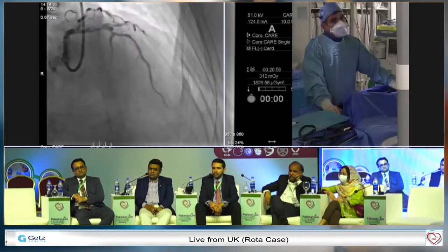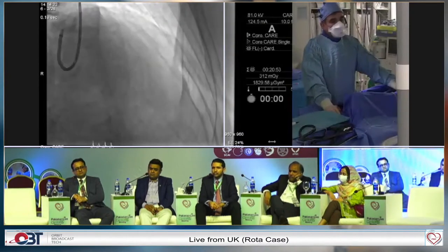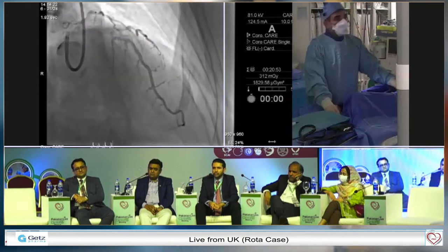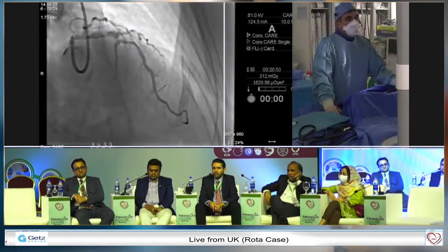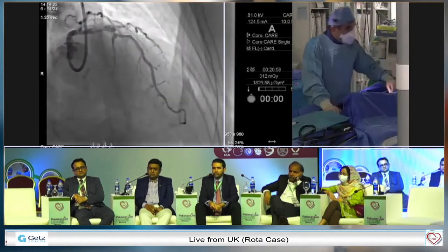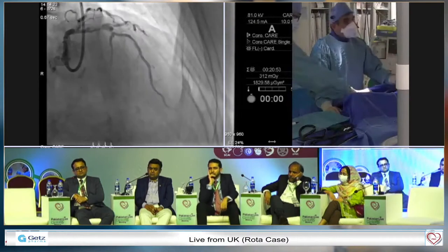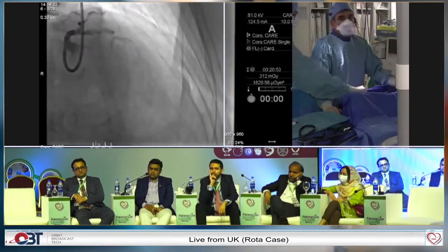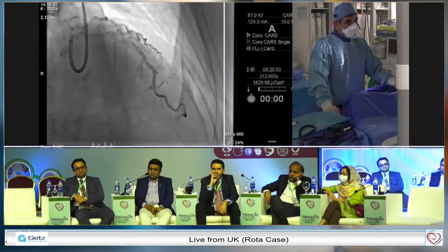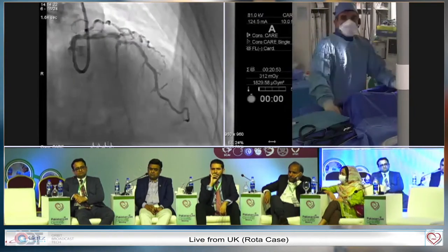Usually with particular cases like this, severe stenosis and the aneurysm, I would start with a small burr first. Of course, it's not going to be the end, because a small burr might not do the job completely, but it'll help me upsize. This is what I did. We took a 1.25 burr. We wired the LAD using a hydrophilic wire and microcatheter, in exchange to an extra support rotawire. Extra support rotawire is what I use in probably 98% of my cases.